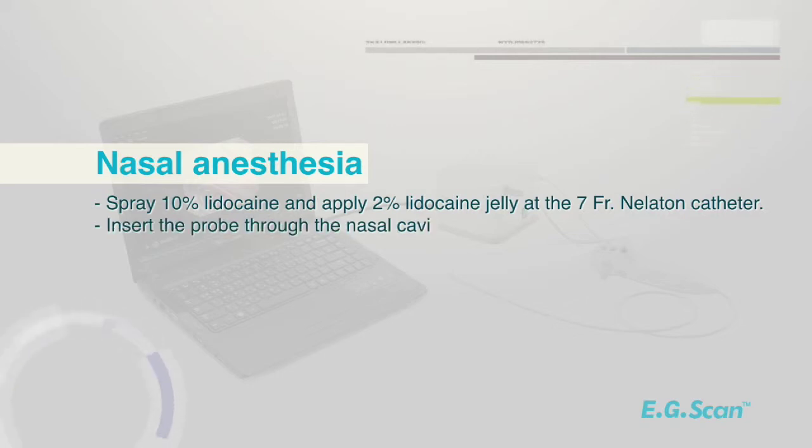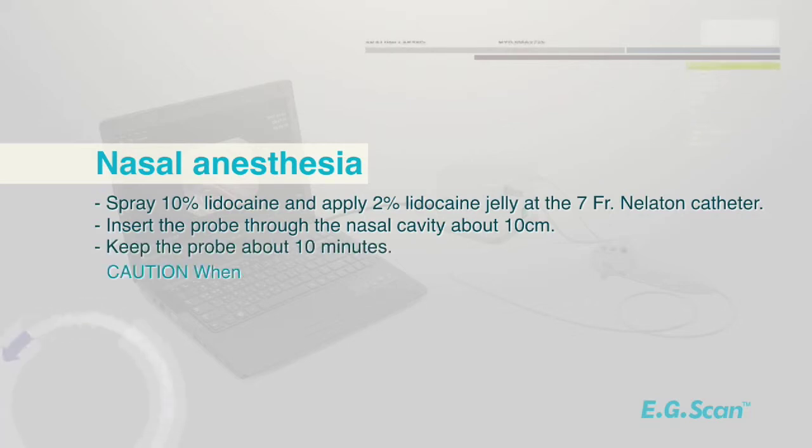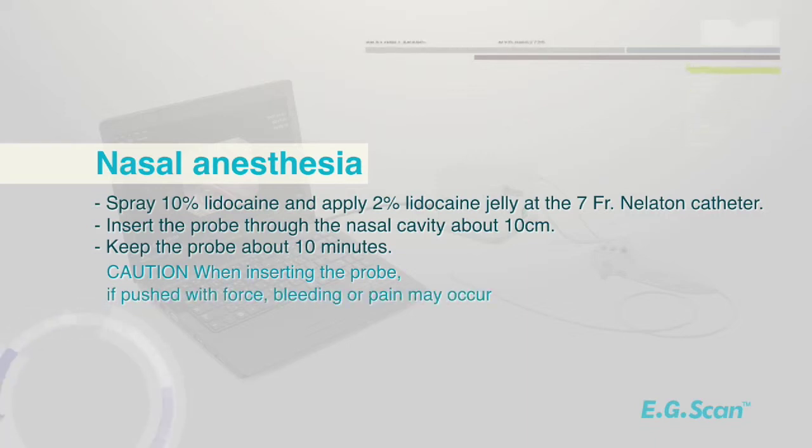Insert the probe through the nasal cavity about 10 centimeters. Keep the probe about 10 minutes. Caution: when inserting the probe, if pushed with force, bleeding or pain may occur.